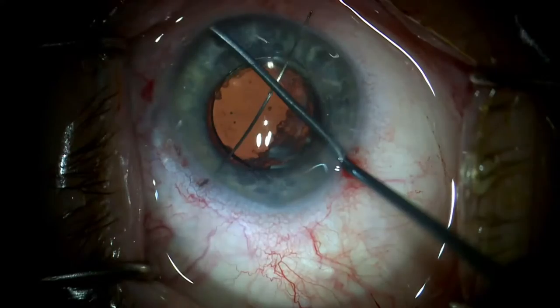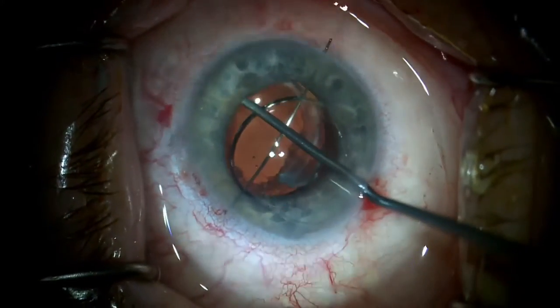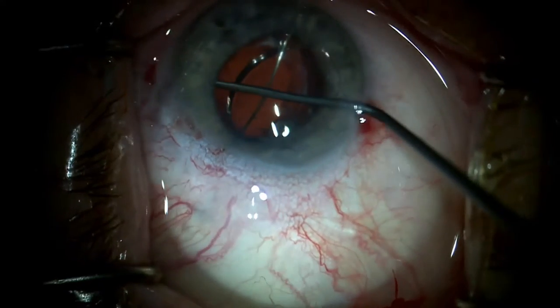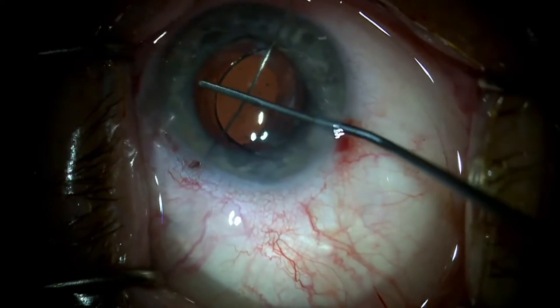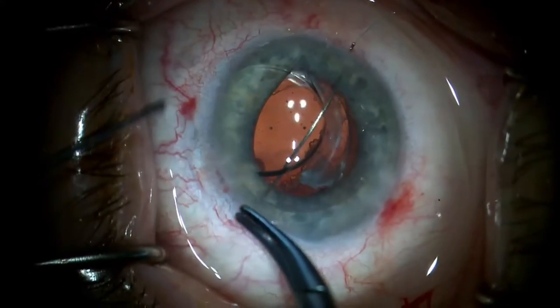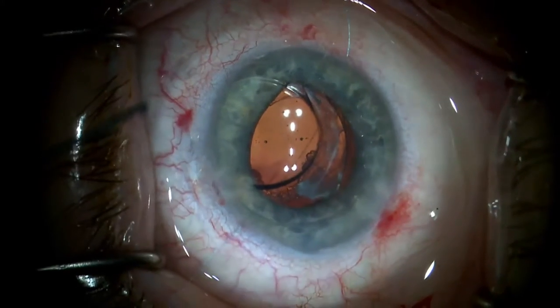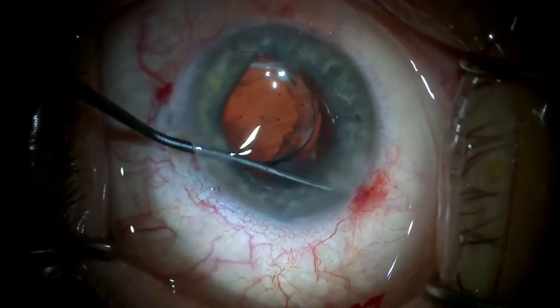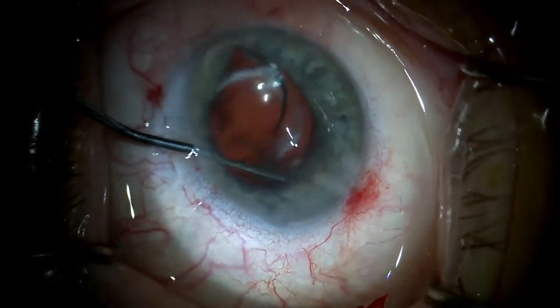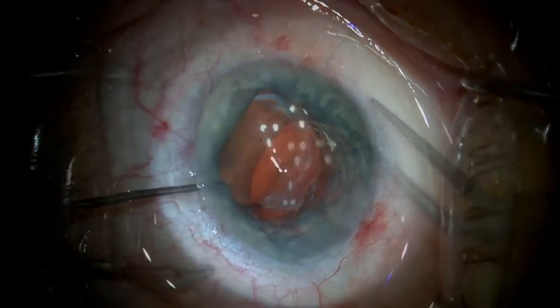With the optic held anteriorly by the trans-chamber needle, one haptic is tucked back behind the iris. Often the needle can be used to hold the optic anteriorly during the procedure, but with this stiff IOL, the needle is pulled through so that there is just 10-0 polypropylene suture behind the optic before the second haptic is placed behind the iris with an angled manipulator.